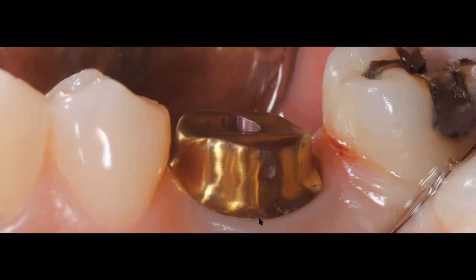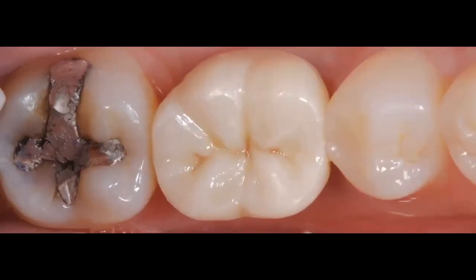There are also good techniques using a 3D-printed copy of the abutment to pre-load cement into the crown, minimizing excess cement at delivery. After sealing the access hole with Teflon tape and delivering the crown, minor occlusal adjustments are made and the restoration is highly polished. The final full-contour zirconia restoration, stained by Oral Arts Dental Laboratories, shows a very natural appearance.